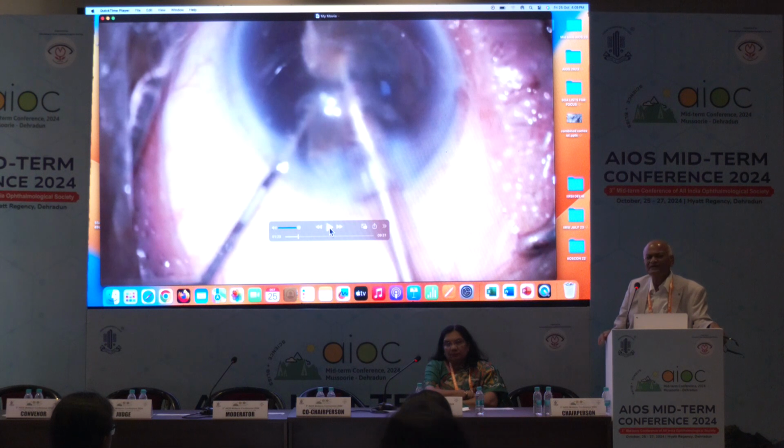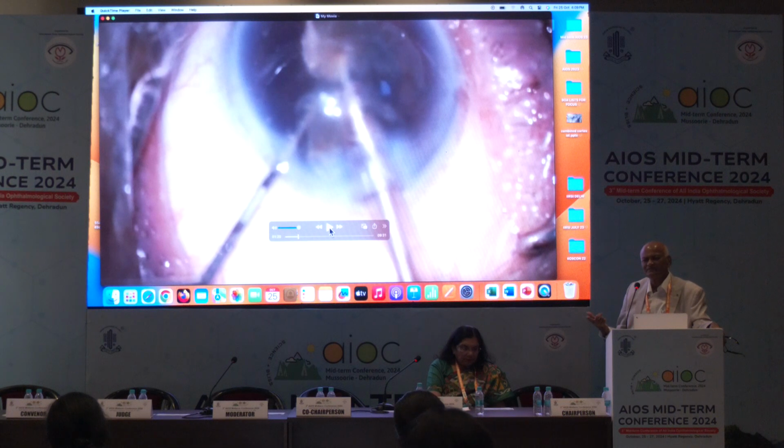Intelligent phaco, but what has happened is that in every machine there is no intelligent phaco. We are considering the upper machines, or the small machines, because all those machines are there. Of course there are AI modes, but that is in Centurion. But in the non-Centurion machine, I will tell you how to do it.